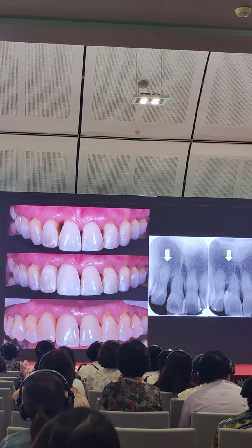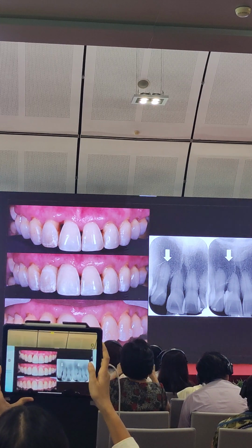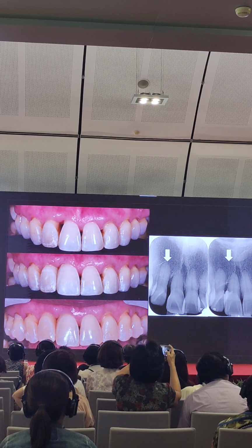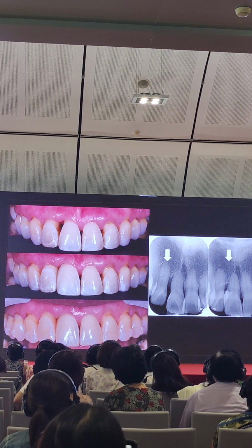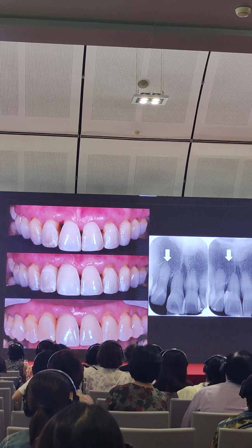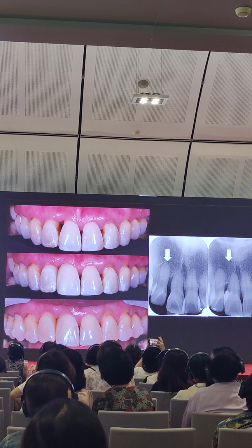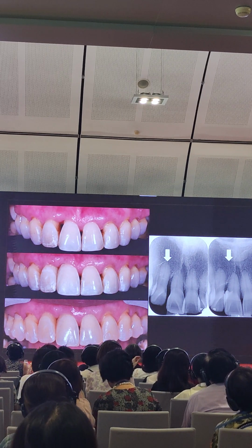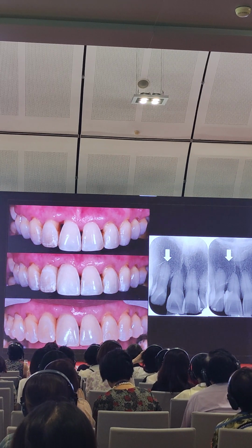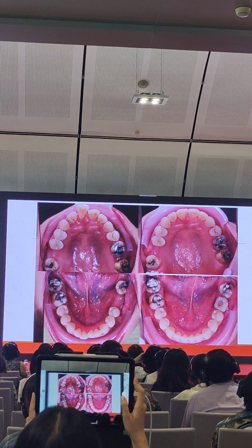It becomes better and better, up to the extent that some of the papilla grow back, and you can see some of the angular bone loss has been resolved by nature, by the patient itself. As long as we've given a better environment, cleaner, more well aligned, and made sure it has no premature contact. So sometimes it's just a miracle.